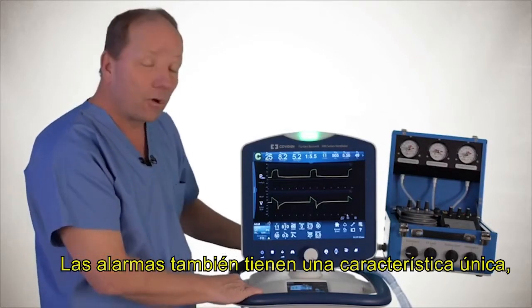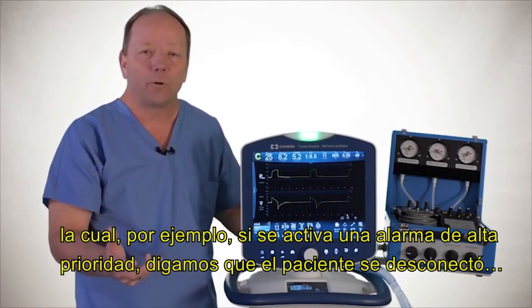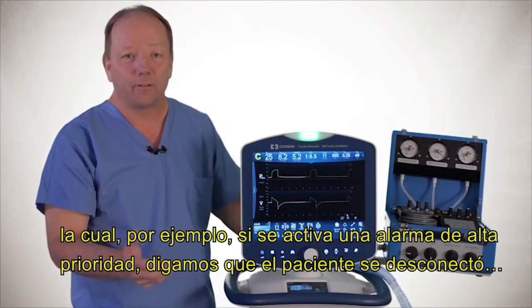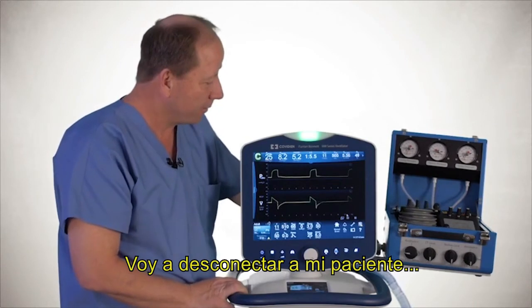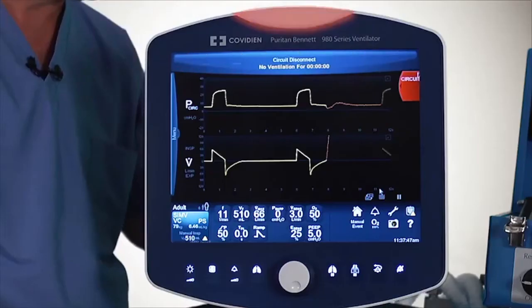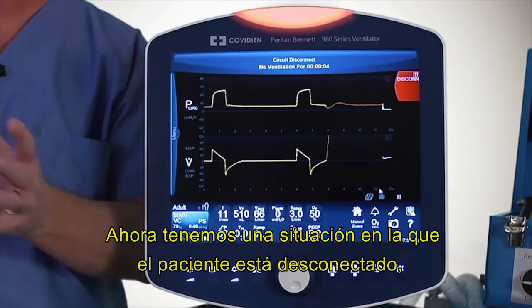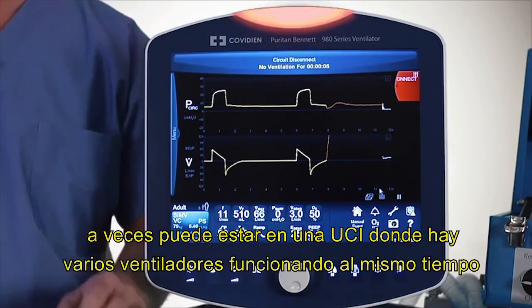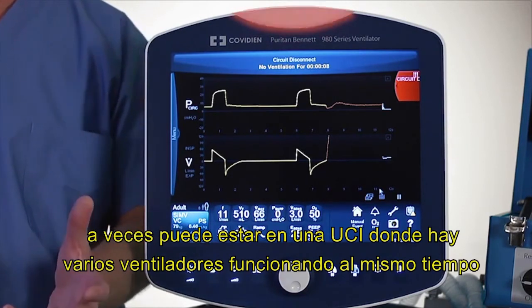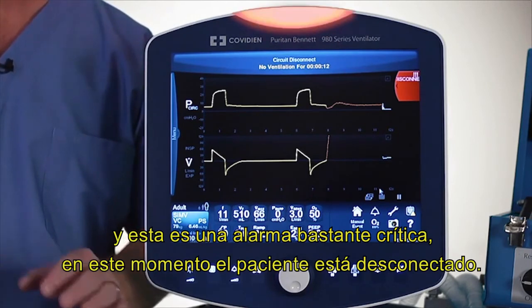The alarms also have a unique feature in that, for example, if a high priority alarm went off, let's say that the patient got disconnected. And I'm just going to disconnect my patient here. Now, we have a situation where the patient is disconnected. Sometimes you may be in an ICU where there is a number of ventilators going off all at the same time. And this is a pretty critical alarm. Right now that patient is disconnected.